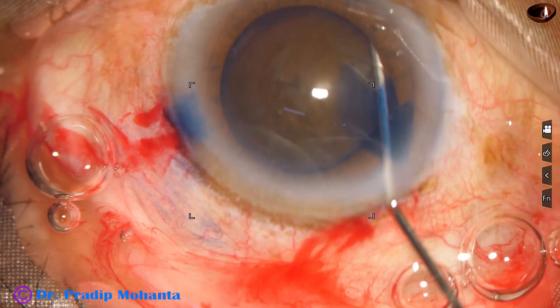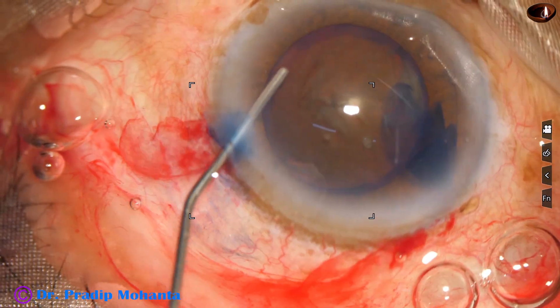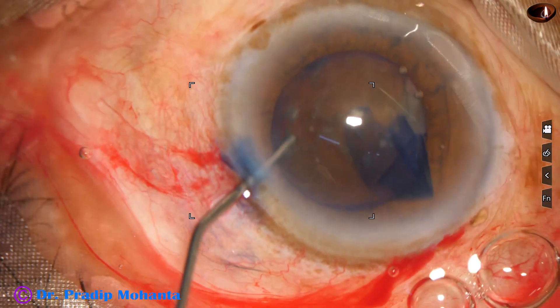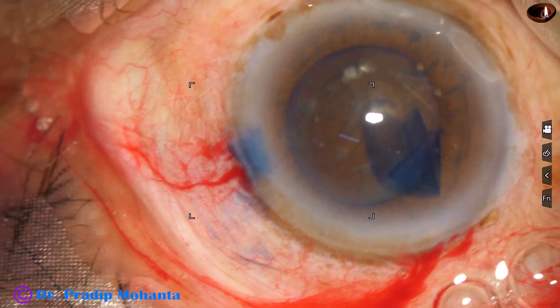Hydrodissection is done. We cannot see the fluid wave. We just have to inject small amounts of Ringer's lactate or BSS at multiple points, mobilize the nucleus, and ultimately the nucleus rotates.